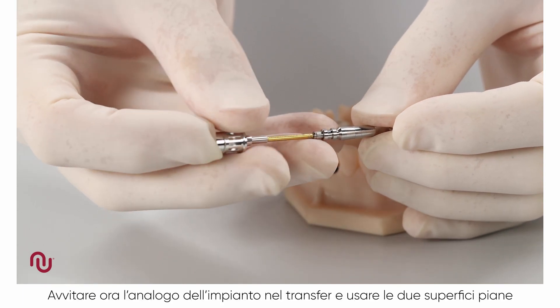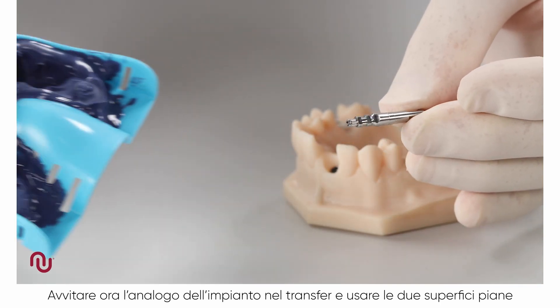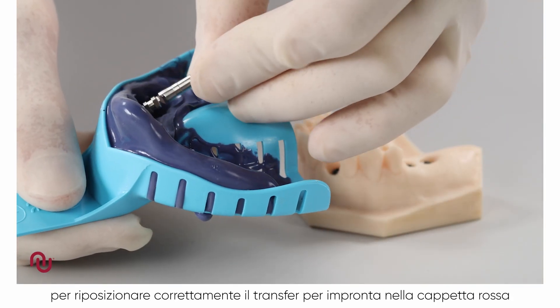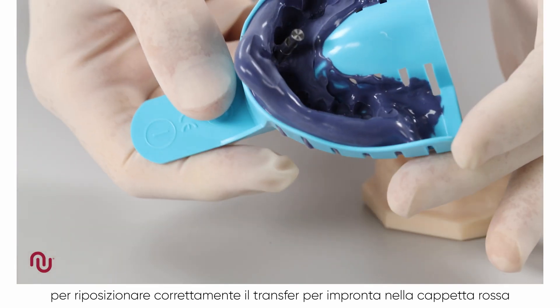We now screw the implant replica onto the impression coping and, utilizing the two flat surfaces, we reposition the impression coping into the correct position within the red plastic cap.